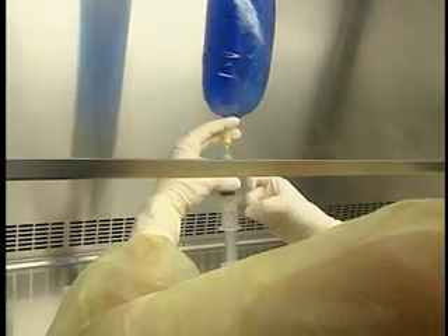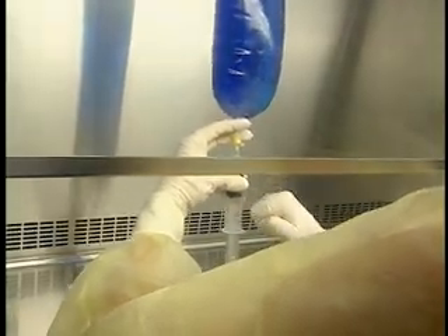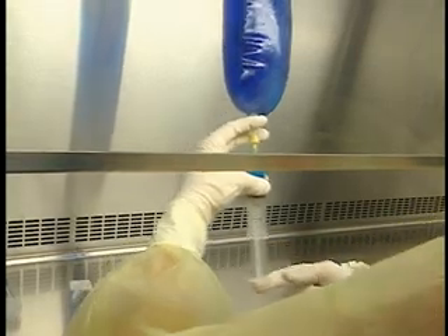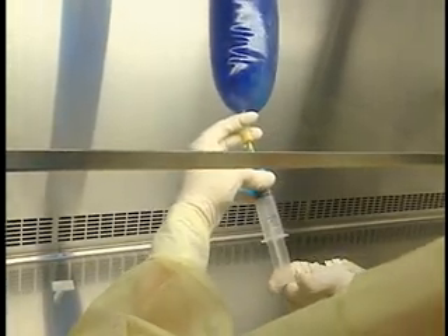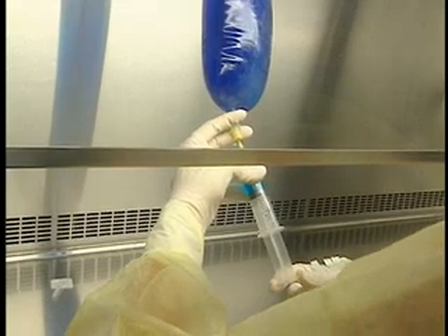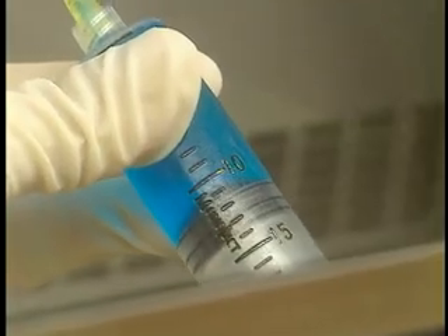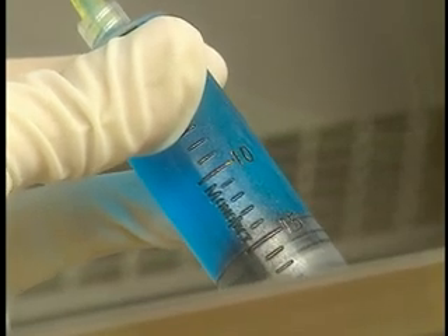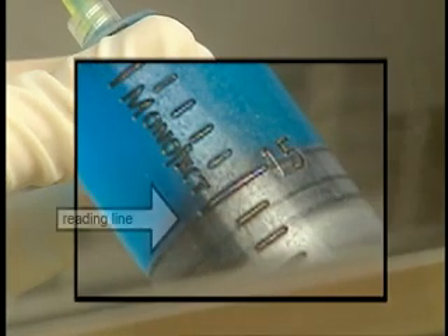Return the syringe to a vertical position and clear any air bubbles, tapping with your fingers to free the bubbles from the rubber of the plunger. Expel the air by pushing on the plunger. Before removing the needle, adjust to the required volume by lining up the outside edge of the plunger — the part in contact with the fluid — with the graduation indicating the desired volume.